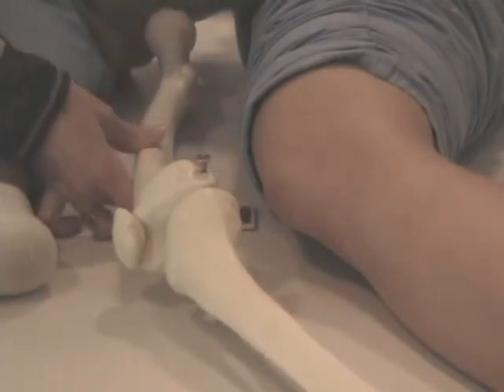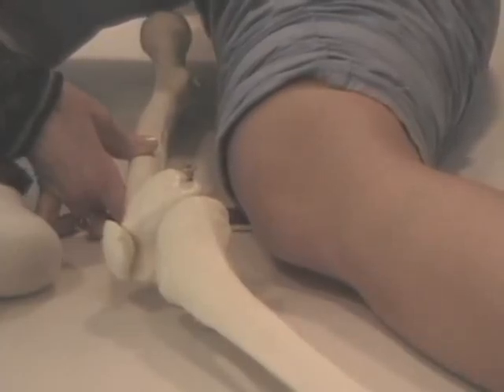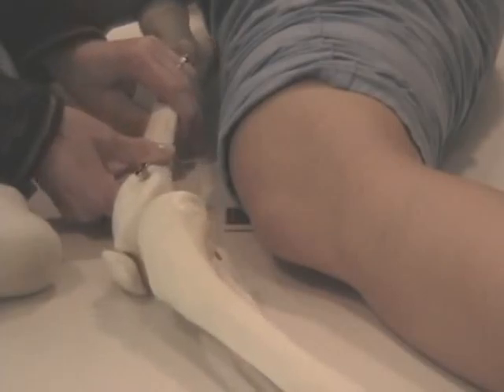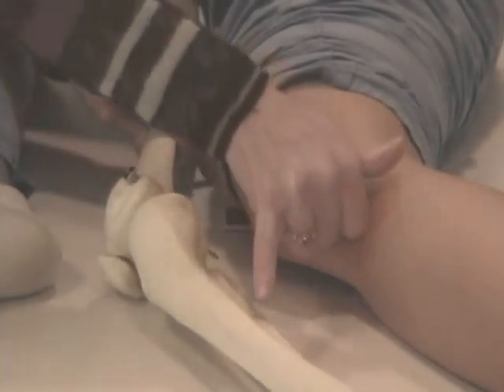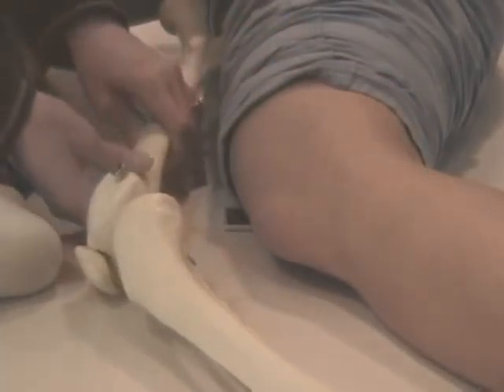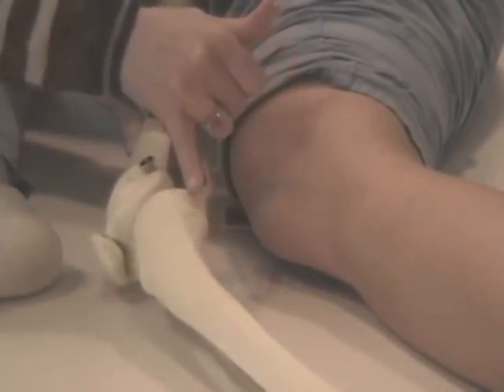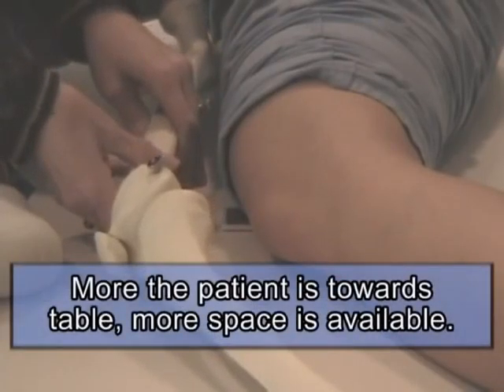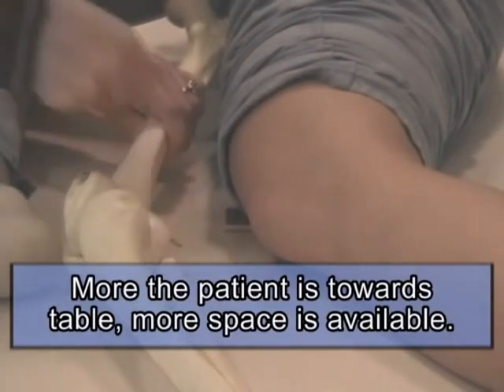If the patient is over-rotated, see how that leg is getting closer to the table? This is what's going to happen. See what the skeleton has done? It has opened the space between the fibula and the tibia. In a normal position, the head of the fibula is slightly superimposed or overlapped into the tibia. But the more the patient is towards the table, the more that space opens up.